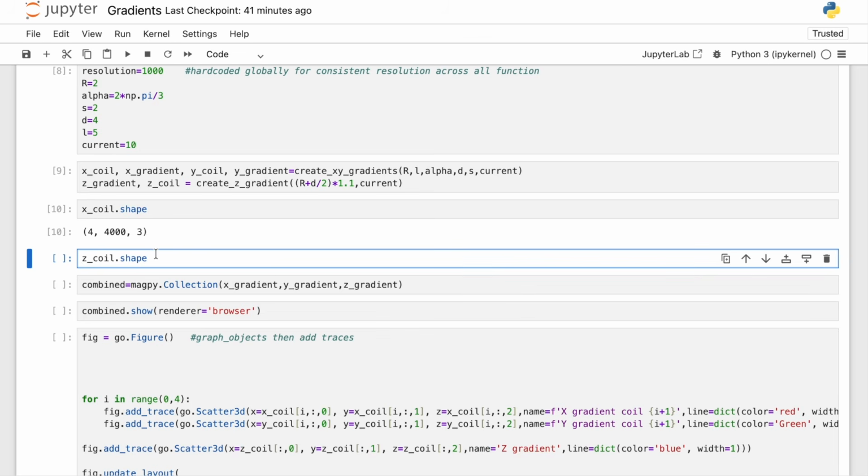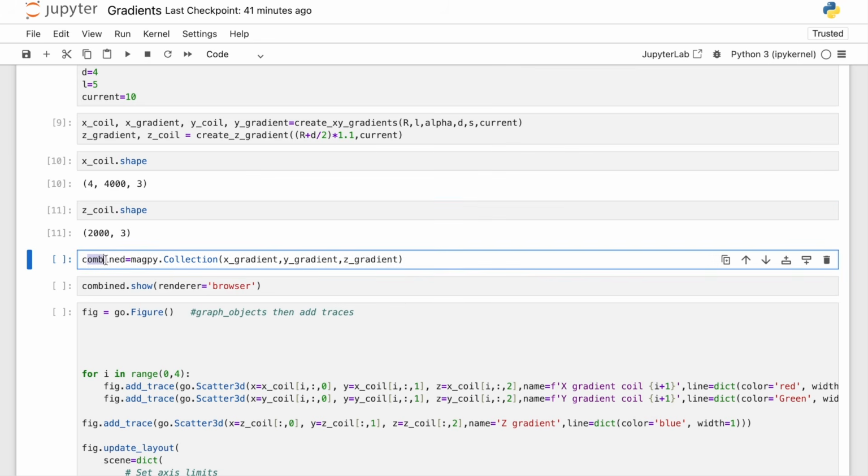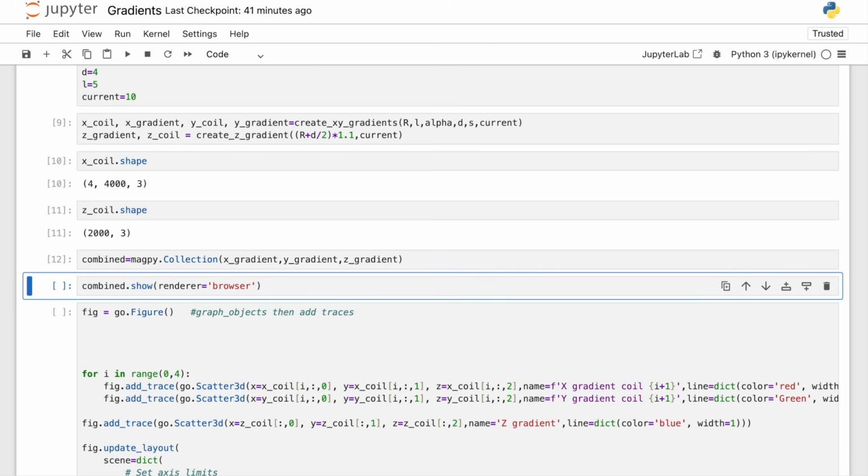Z coil was simpler. Let's run and see. The shape would be 2000 by 3. Why? Because it just was 2 coils. So here we see that. We can also define a combined coil which combines x gradient, y gradient, and z gradient. So this is a combination of all coils we have. This is a nice and easy way to just visualize everything in one go, really fast. So let's run this and see.